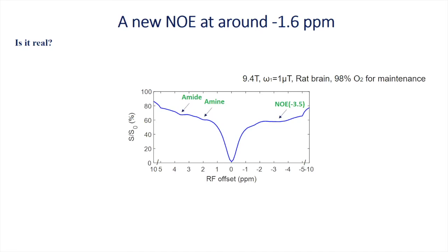Second, how can we remove the MT and other non-specific factors? There are many approaches now, but I think the next step is important: to translate them to 3T MRI. And the third issue is that we found that protein has a great contribution to CEST molecular imaging. So interpretation of CEST imaging metabolites should be careful.